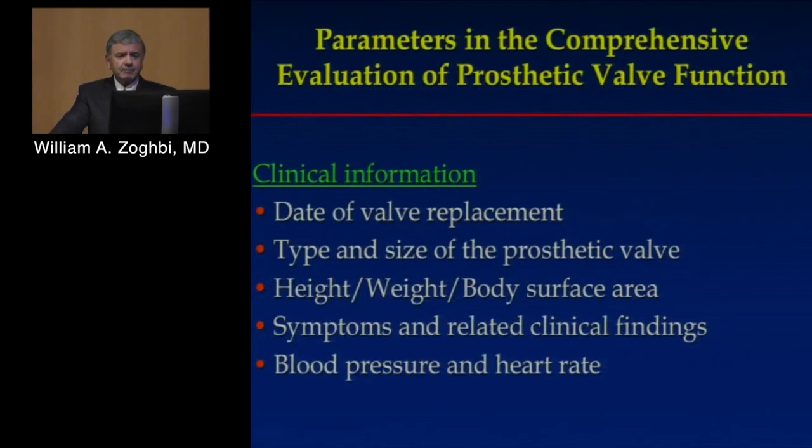There is little data. Now, for the clinicians in the audience, and even the sonographer, you'd really like to have some clinical information regarding these patients who have prosthetic valves. One, the date of valve replacement. I think that's overall good, because you need to know whether there's a dysfunction very early on after placement. Then type and size, and I think this is crucial. For the sonographers and the clinician, you need to know that at one point in time.